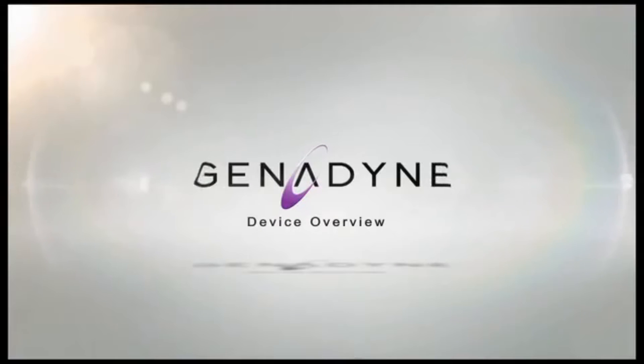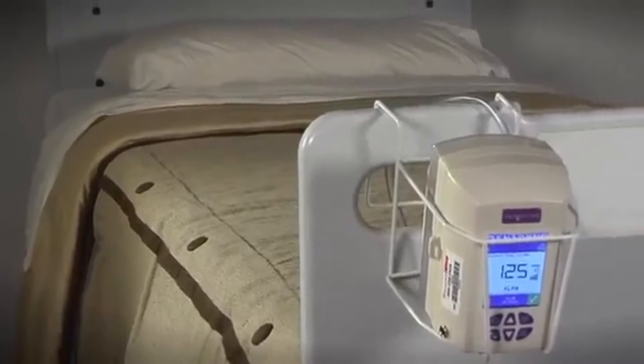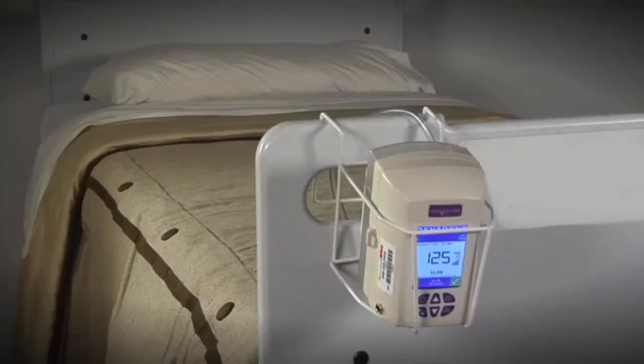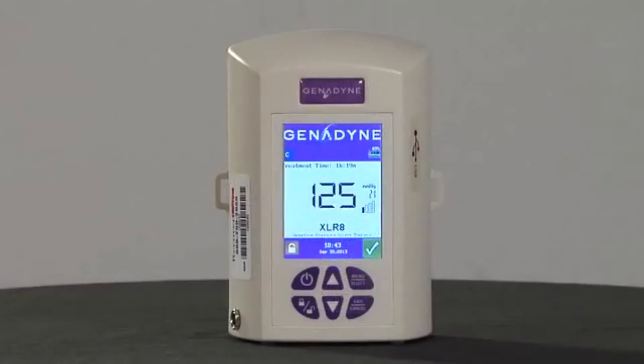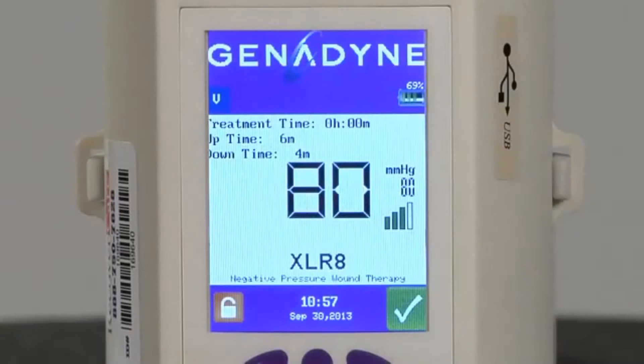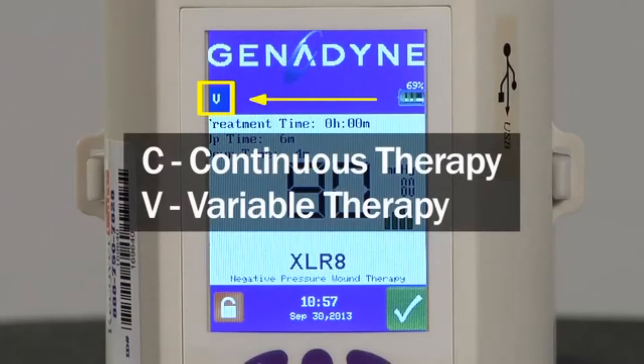Device Overview. The Accelerate Pump weighs less than 1.5 pounds and offers the flexibility of both bedside and ambulatory therapy. All information pertaining to pump operation is located on the front panel. The therapy mode icon is displayed in the upper left corner — either a symbol C for continuous therapy or V for variable therapy — and is always displayed to indicate the type of therapy being delivered.